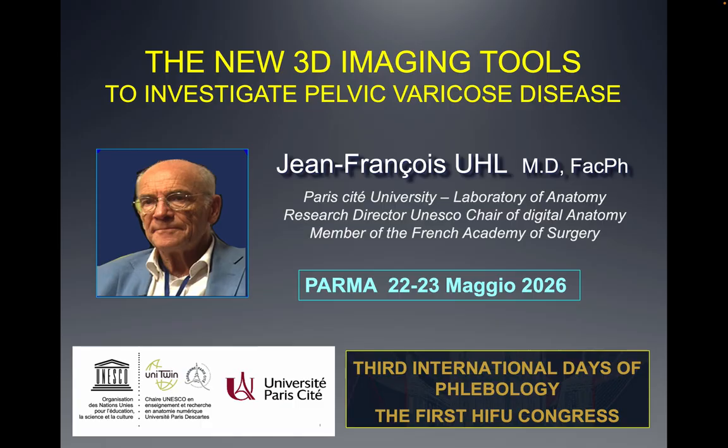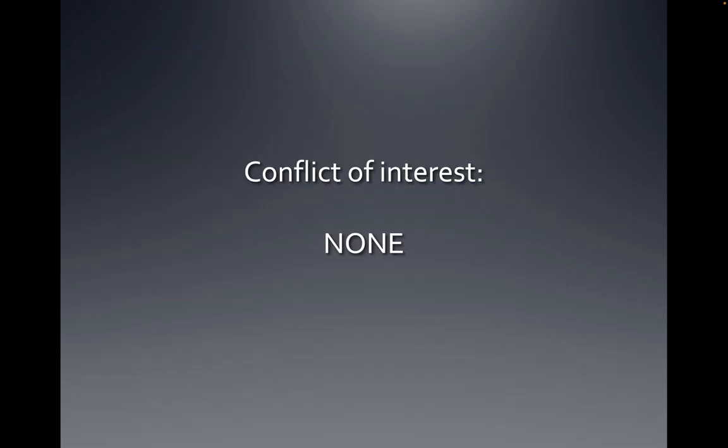My talk is about the new 3D imaging tools to investigate the pelvic varicose veins. I have no conflict of interest.